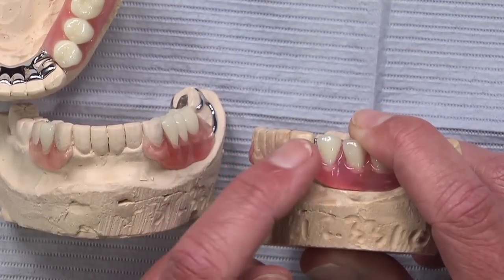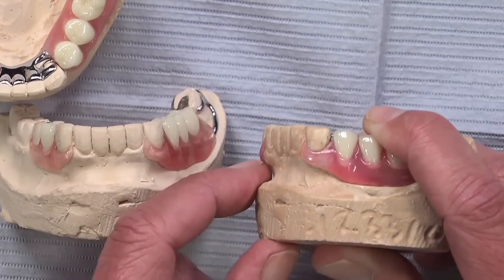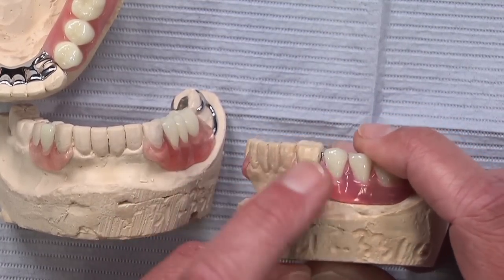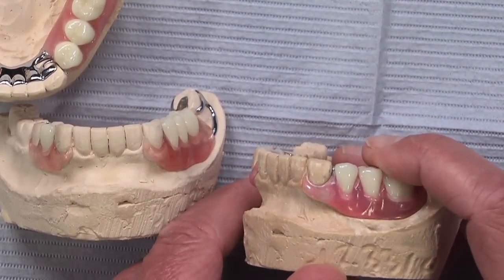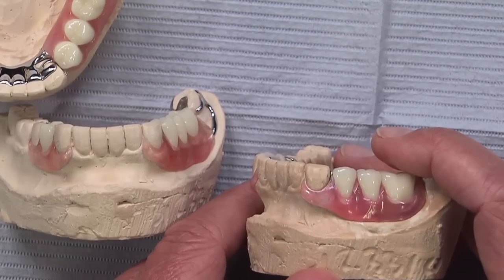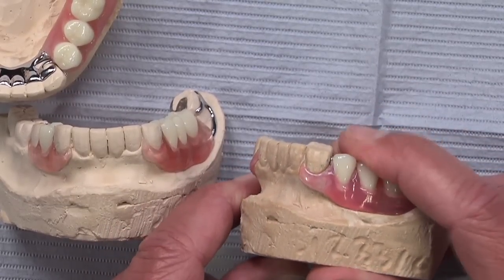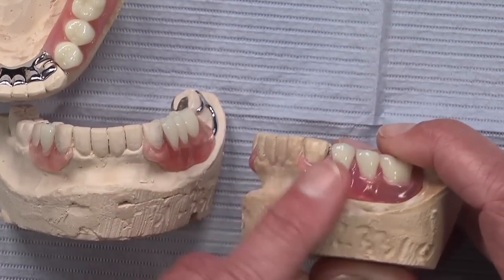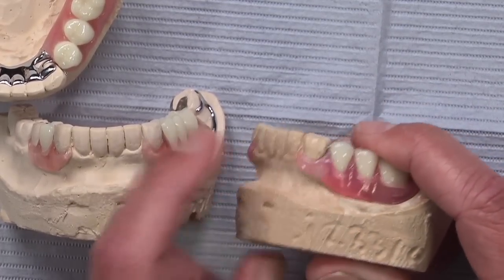You can mark that area on the tooth with a little skin marker or something, and then take the partial off and build a little composite and bond it into place, just occlusal to where that clasp is. It takes a little bit of skill to create a height of contour on your own. The first time you try it back on, the partial won't snap into place over that little bulge. But as you go in with discs and polish it, bringing it back a little bit at a time, you finally get it in, and you've got something that's going to be there forever.